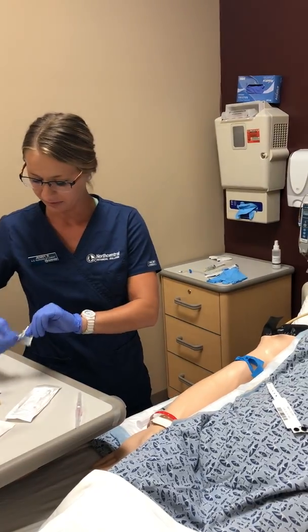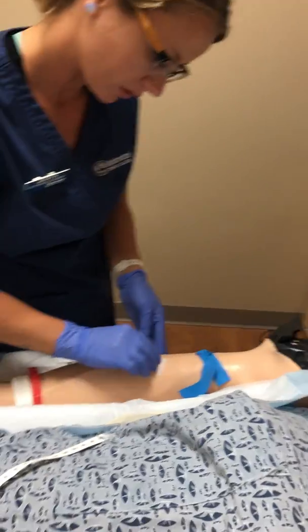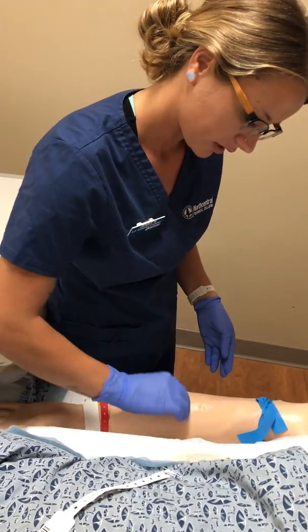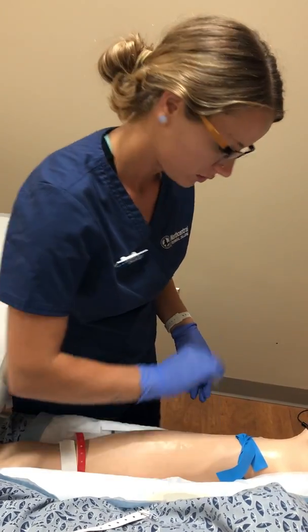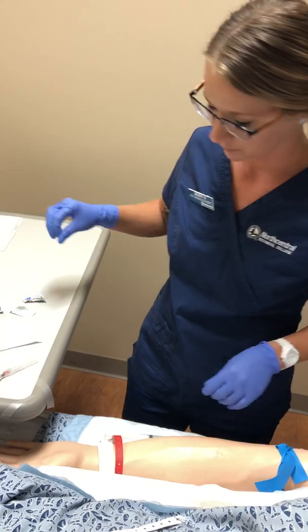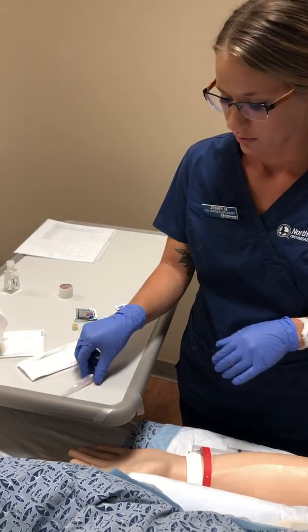I'm just going to cleanse my site. Looks like right here in the antecubital. I'm going to cleanse in a circular fashion, moving outward for about 20 seconds. Toss that. Let that dry. Okay, yep, good pulse.